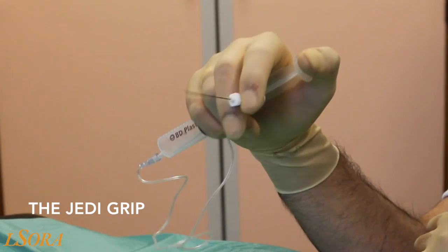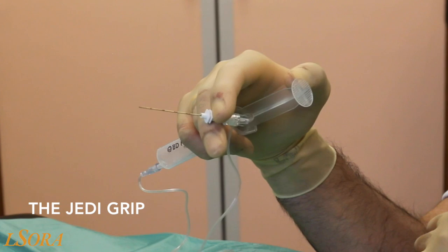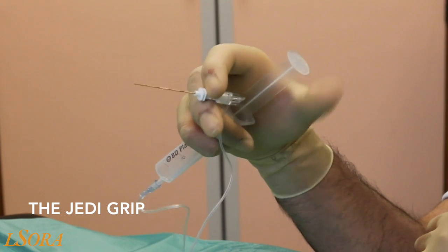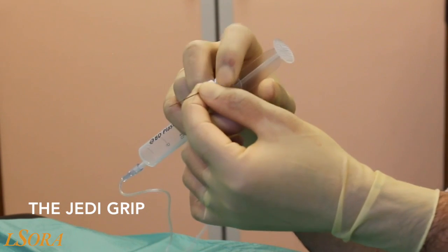The needle is placed in between the index finger and the middle finger. The needle can be advanced using this movement. Aspiration on the plunger is possible with the thumb; however, you do lack some of the accuracy of the standard pincer grip movement, demonstrated here.